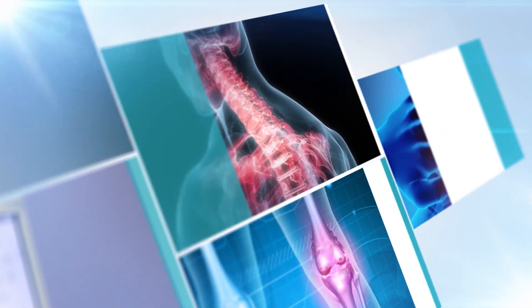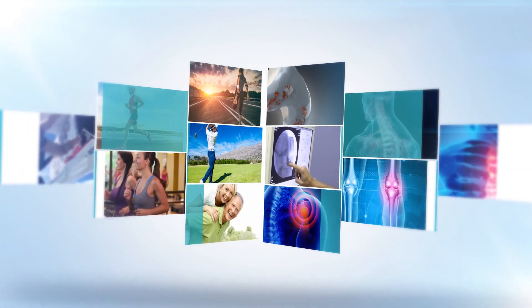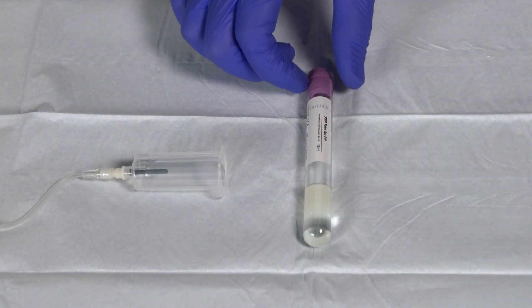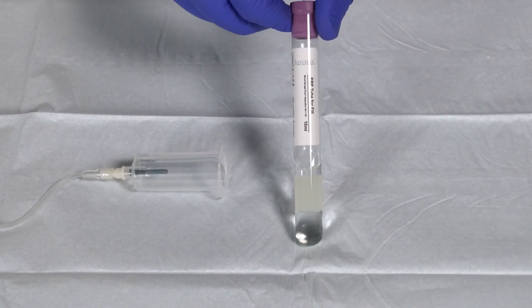Hello and thank you for choosing Juventix Regenerative Medical for your clinic's regenerative medicine needs. This video will demonstrate how to properly prepare a whole blood sample into a hyaluronic acid and platelet-rich plasma combination using the Juventix Regenerative Medicine HAPRP kit.